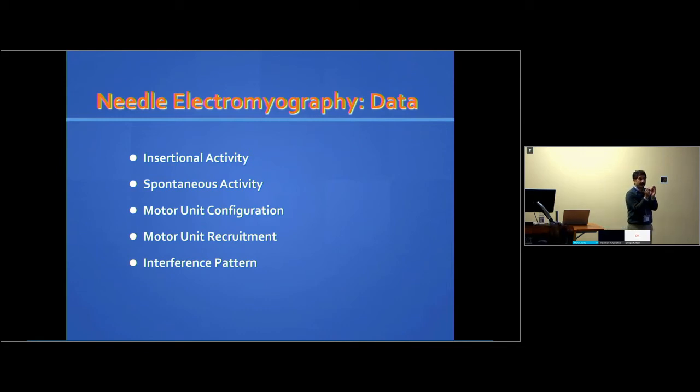If I have, say, 5, because 5 are lost due to axonal loss from nerve injury, then those 5 have to fire double. So the firing rate of each unit is increased. That's what we call reduced recruitment, because more units are not recruiting in. And then we look at maximum force, how many units generate the maximum force by that muscle.